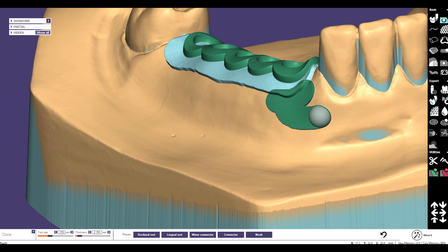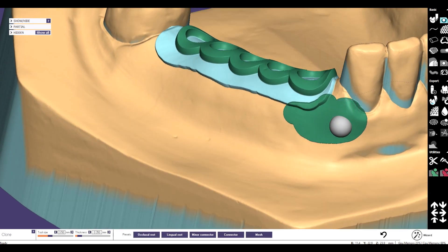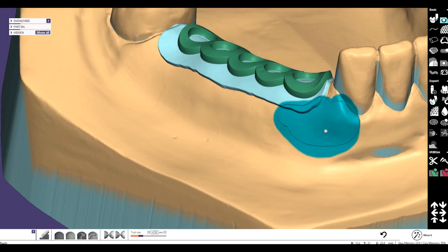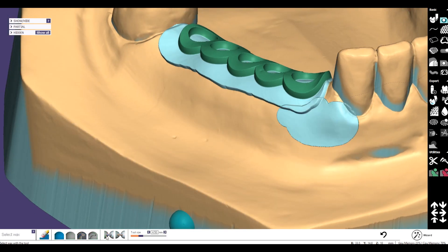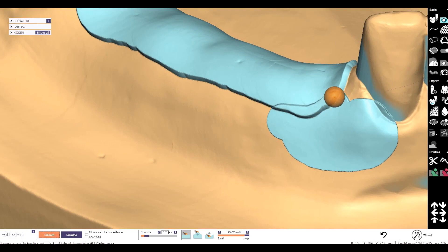Now I mark the area where the arm from the Bonyhard clasp is going over the gingiva, because I don't want to have the gingiva disturbed or irritated. Then I switch again back to the select wax tool, then the clone wax tool, and I also switch to block out wax. Now I go to the smoothing tool to smooth the transitions.